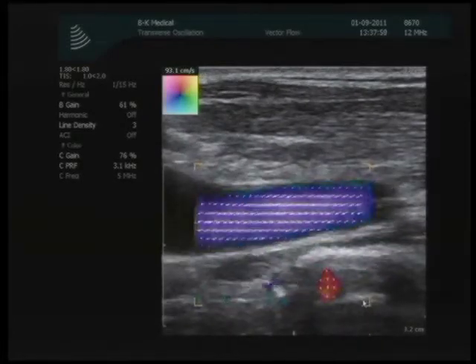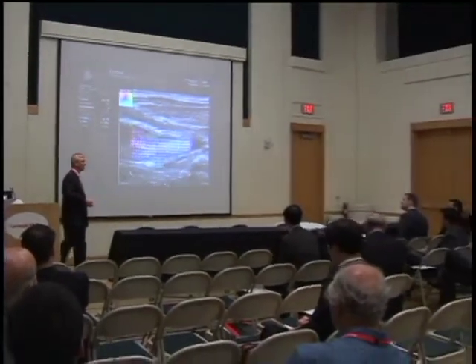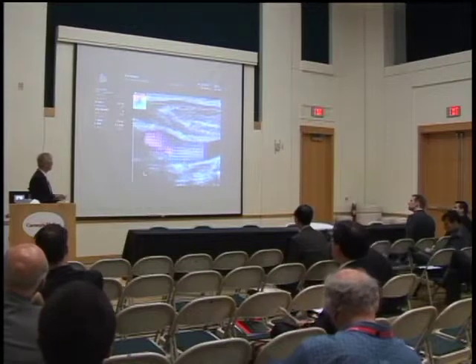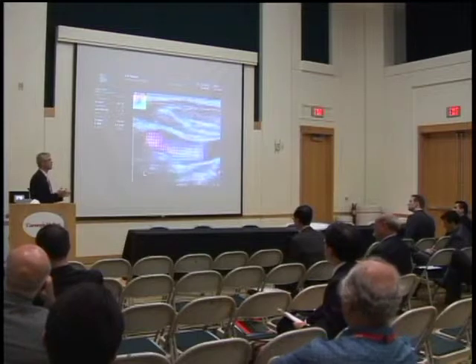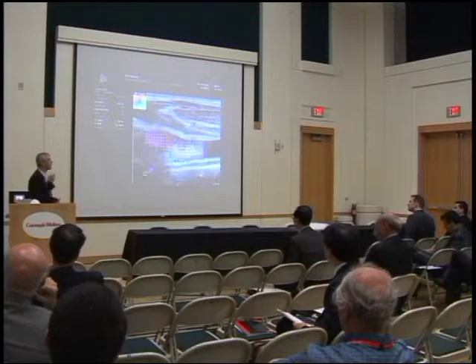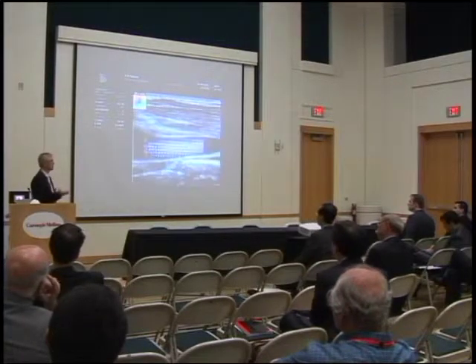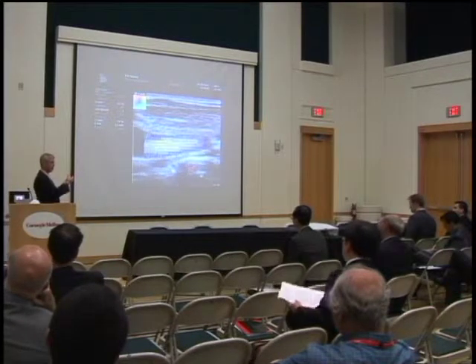Just a quick question. Maybe we'll get to this, but what's your confirmation that this is accurate? I mean, that this vortex is forming? Is there some independent metric by which you can say, yes, exactly? Well, the thing is that you can also measure this vortex with MR scans. This takes you half an hour. The way we validated this was with MR scans in the carotid artery, looking at stroke volume. So there was more than a 90% correlation between the stroke volume of MR and this. So of course, you're right. It's really difficult to say what's actually going on.